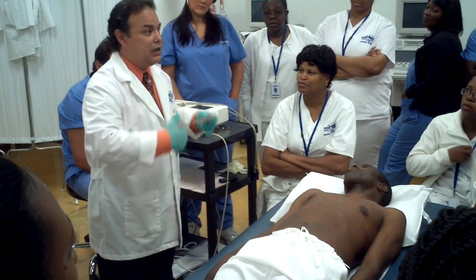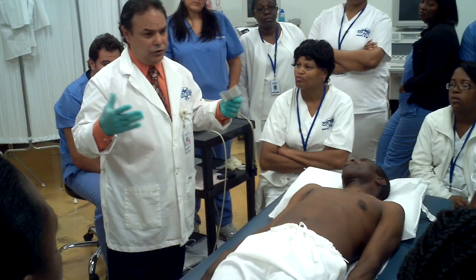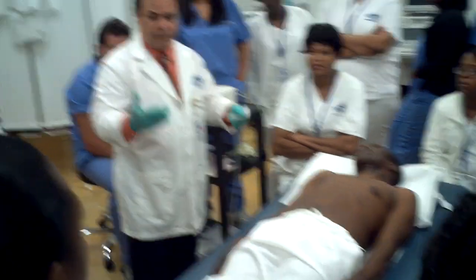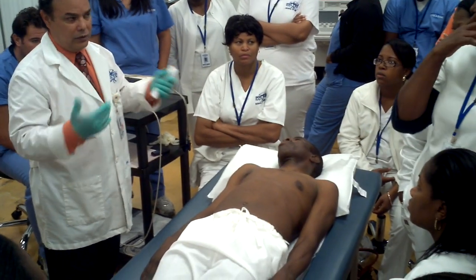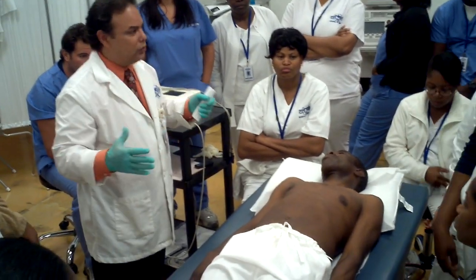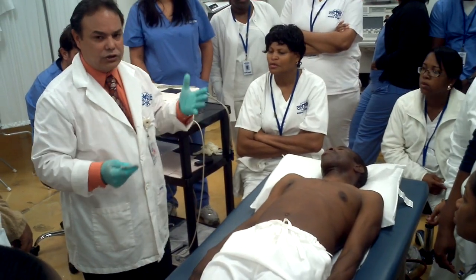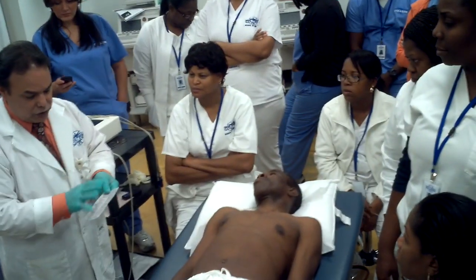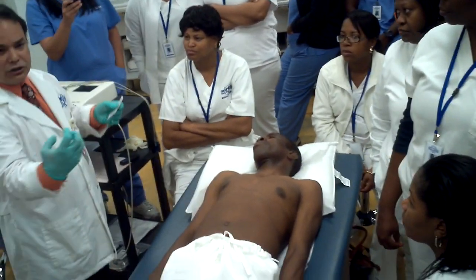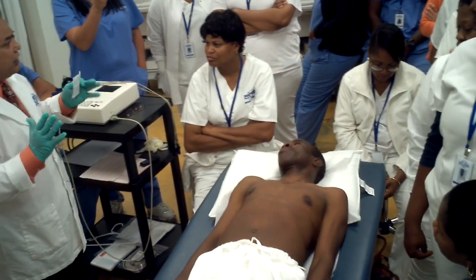It's not hard. It's a matter of repetition, repetition, repetition. Whenever you feel you need help, we'll give you a good course on EKG, a good review on EKG, and we'll help you out. Anybody here in the school is ready to give you a hand. So this is what is called a 12-lead EKG. What we're doing is using 10 electrodes, but it's going to take pictures from different sides of the heart and record it on a graph.